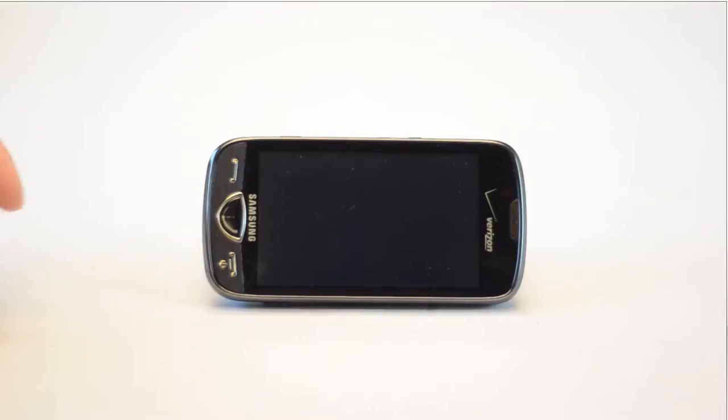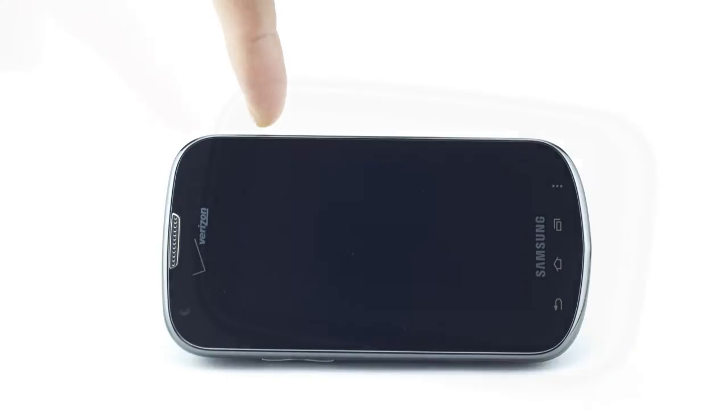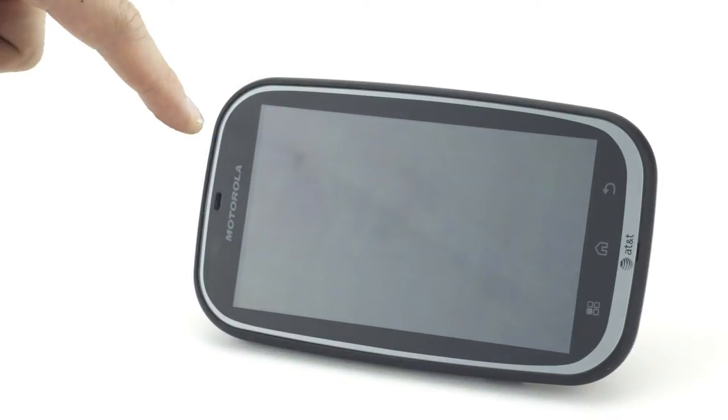Next, turn the PDA on and set it aside. PDA models may vary — please refer to the instructions inside the heart monitor box.